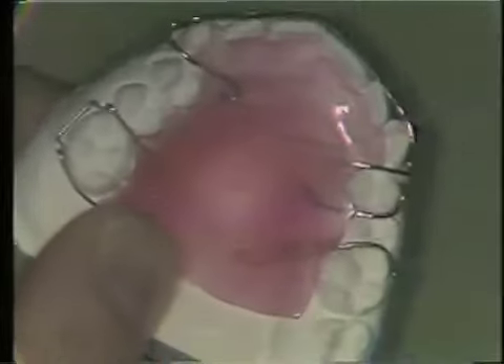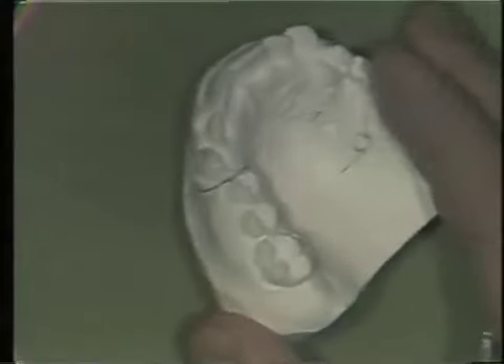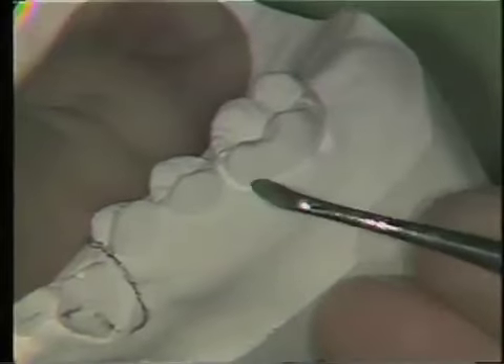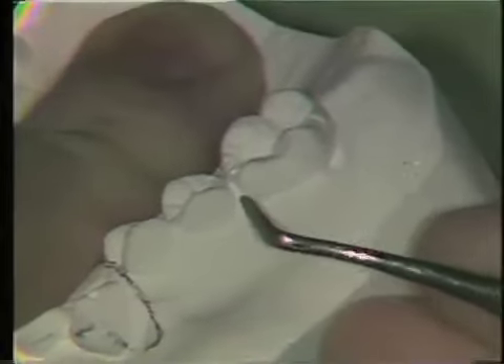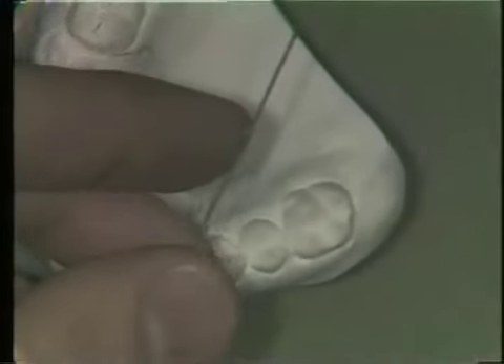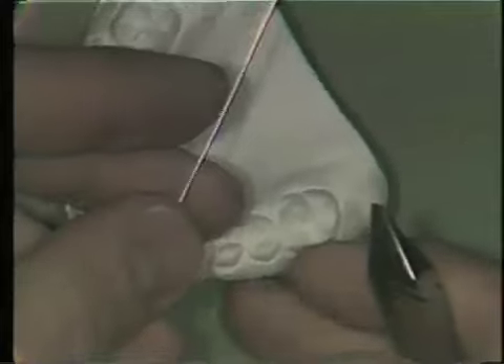To bend an Adams clasp, the first step is to prepare the work model. You must remove about a half a millimeter of the free gingival margin at the buccal proximal aspect, as I'm doing here. Not very much plaster is removed — just enough to allow the loop to engage the undercut area. Adams clasps are made from 0.025 diameter stainless steel round wire and are bent with 139 bird beak pliers.